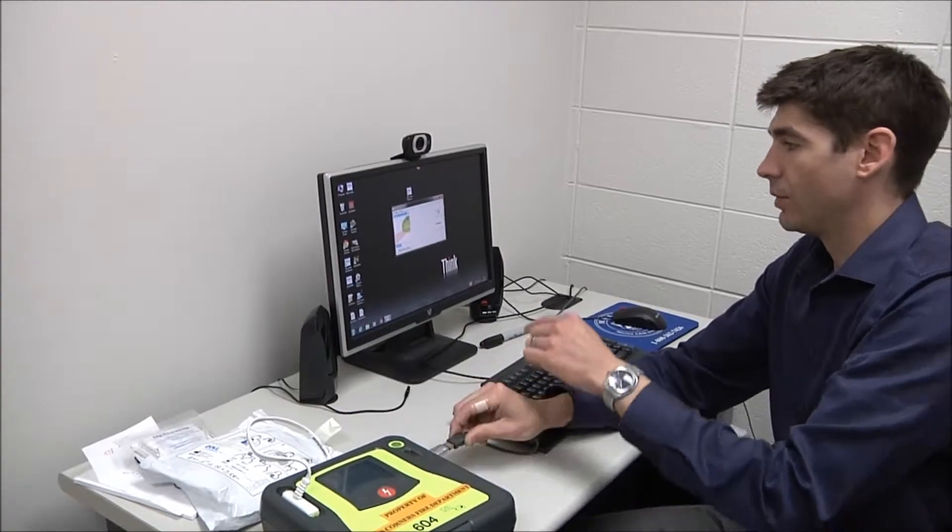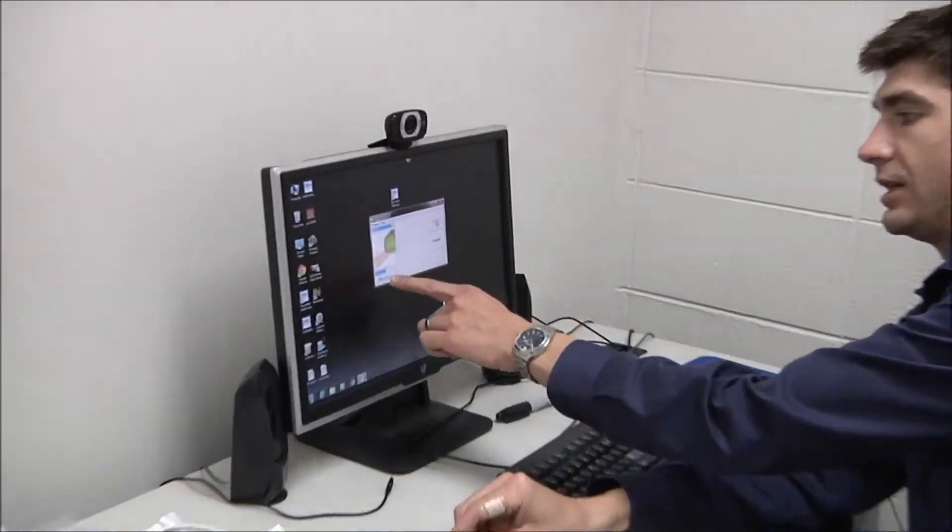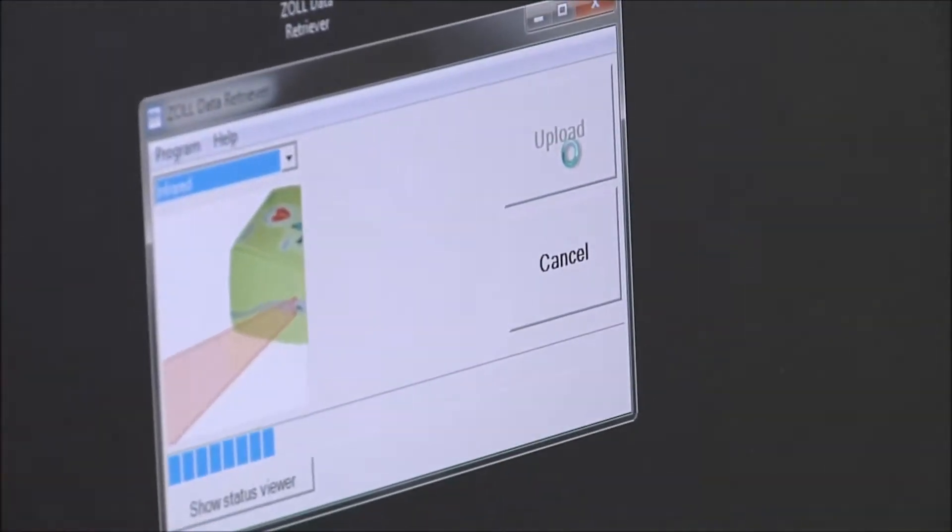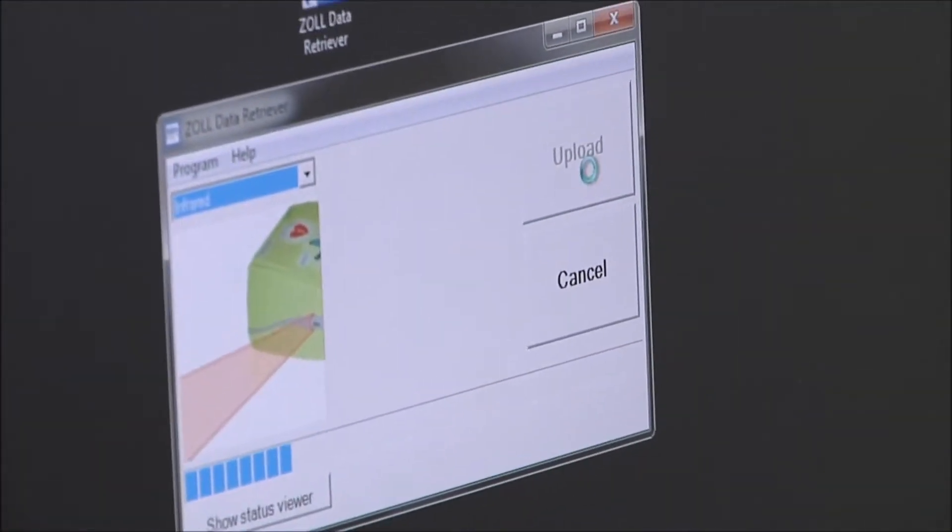So now I can let go of the button and you'll see right here the progress indicator shows that you're uploading data right now.